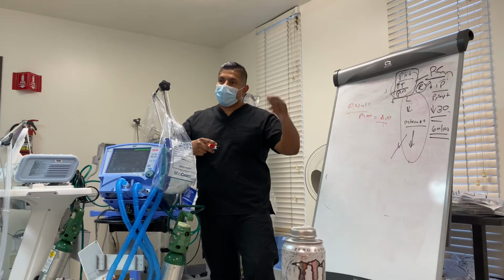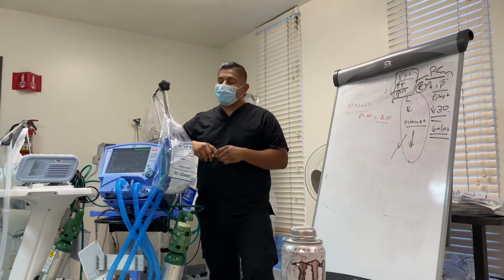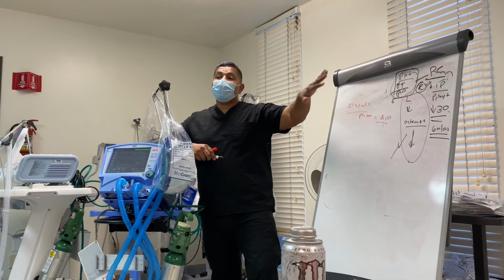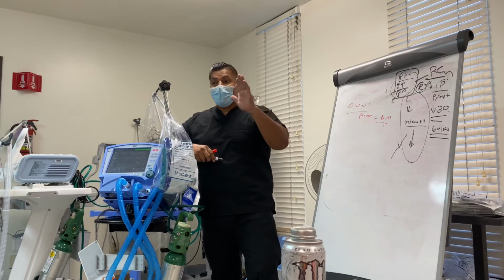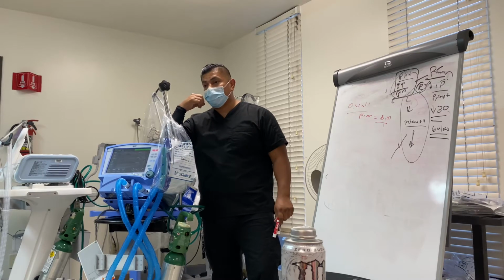It'll change your PIP, correct. And based off of the lung compliance. Exactly. So this is again, set it and forget it. All you have to do is make sure that you have an adequate I time, because I time can cause shearing or lack of volumes to be delivered.